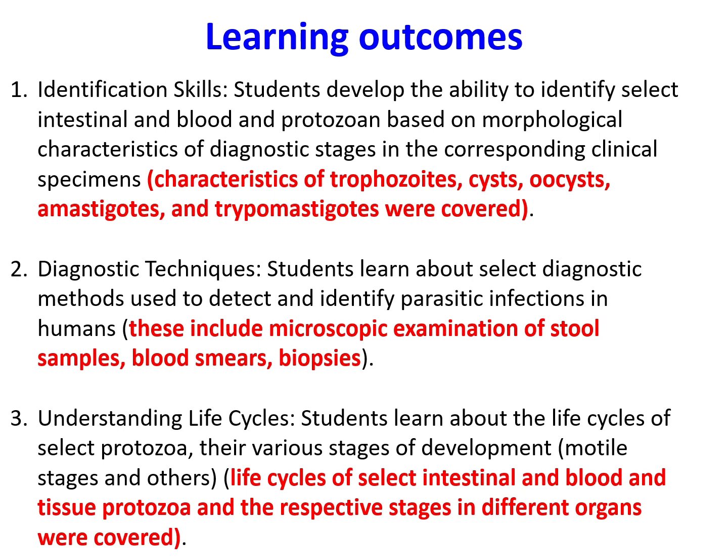They are able to identify the oocysts of different sporozoans, and we focused on Cryptosporidium. They are able to recognize amastigote stages and trypomastigote stages, as well as other stages that exist in case of Leishmania and Trypanosoma.